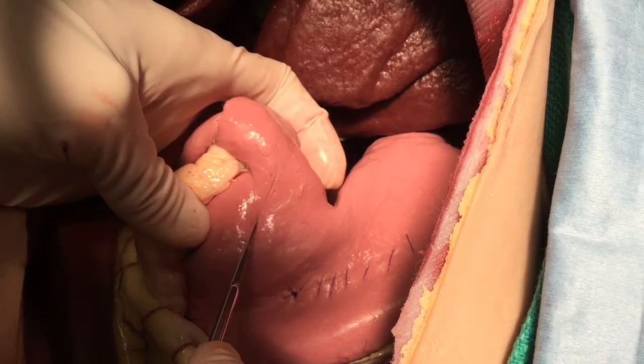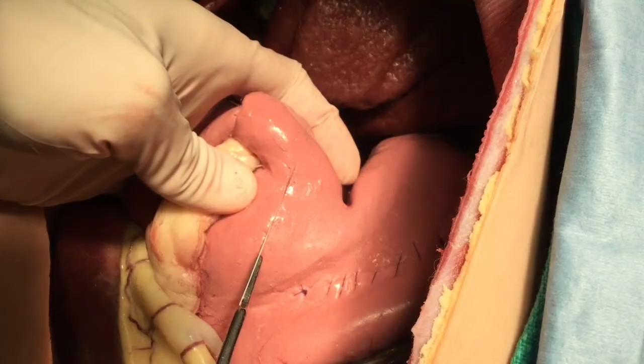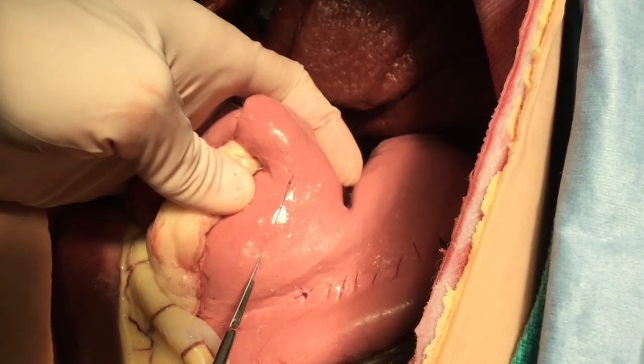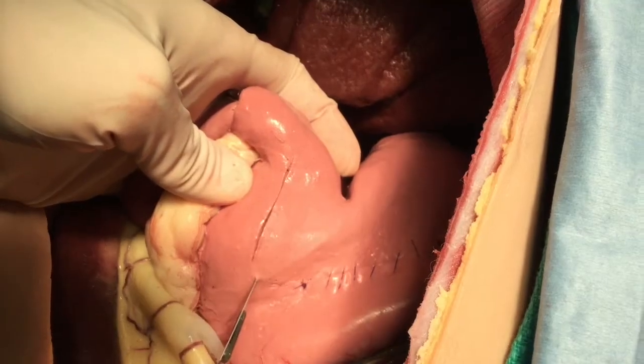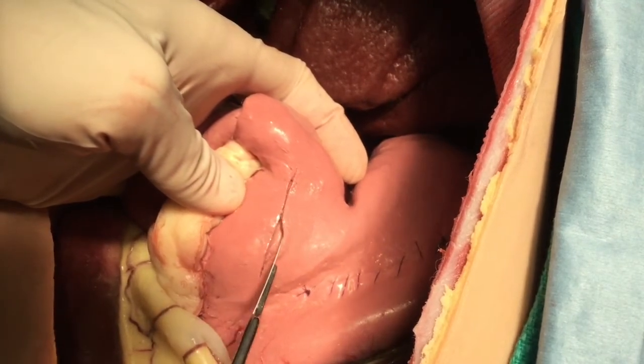A linear incision is made in the middle of the pyloric antrum. This is a partial thickness incision only of the seromuscular layer. The incision is approximately 2 inches long.